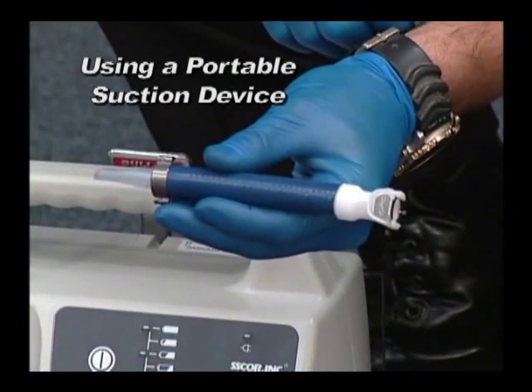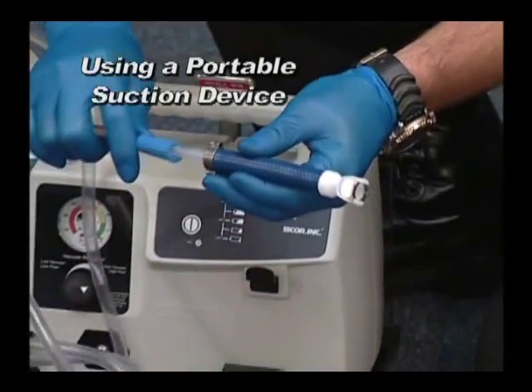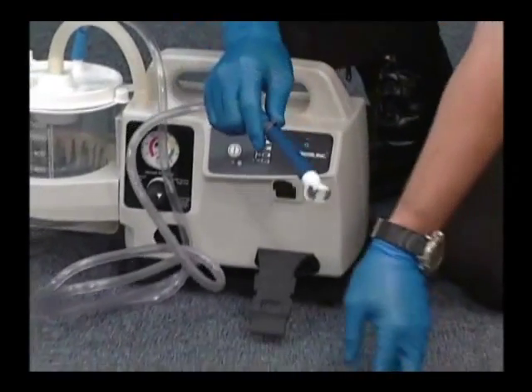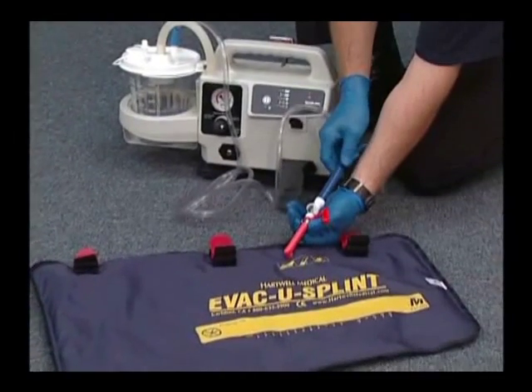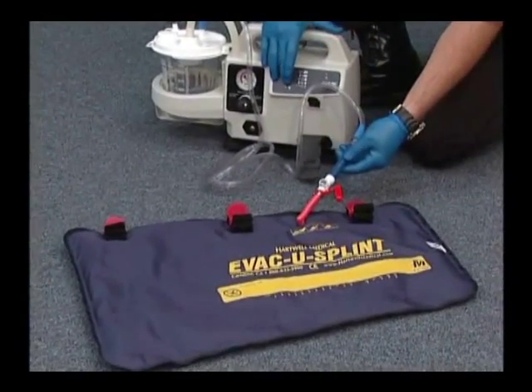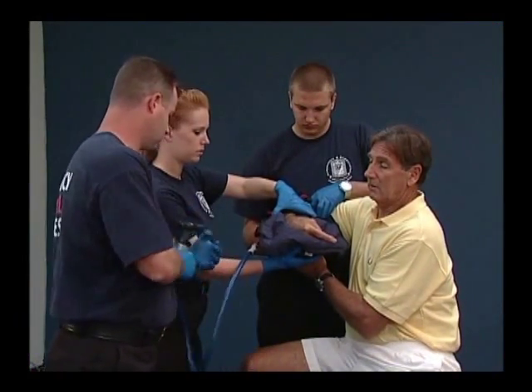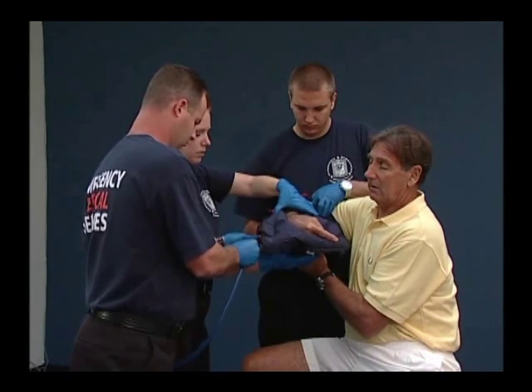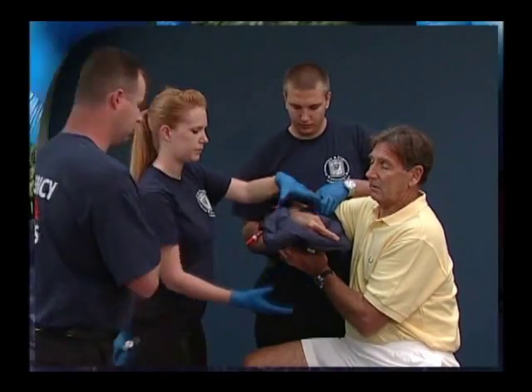If you are using a portable suction device, connect the maxivalve portable suction adapter, or PSA, to the end of your portable suction tubing. While holding the flexible flange tubing just below the maxivalve, attach the vacuum pump hose with adapter to the maxivalve. Evacuate the air from the splint until the splint forms a rigid cast around the injured area. You will feel resistance on the pump handle when the splint has been sufficiently evacuated.